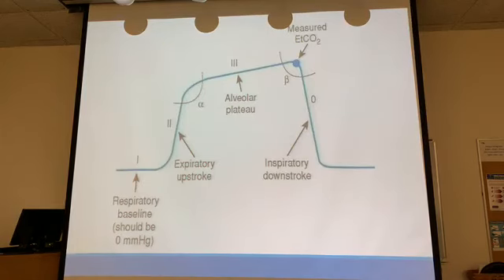So this is your end-tidal CO2. This is your standard waveform that you'll see. Okay, you have your baseline, which should be at 0, right? Your baseline indicates inspiration. So when you're inhaling oxygen, you shouldn't be inhaling any carbon dioxide unless you're breathing from an exhaust pipe or some poison substance. But when you're inhaling, there should be no CO2 going in. So you have a value of 0. And when you start exhaling, all of a sudden it jumps up, because what do you do when you're exhaling? There's carbon dioxide coming out, and that's what you're detecting. So you'll see it jump up very quickly.